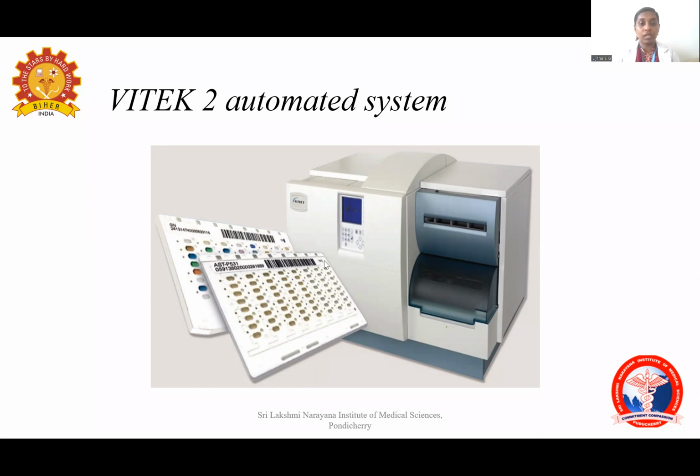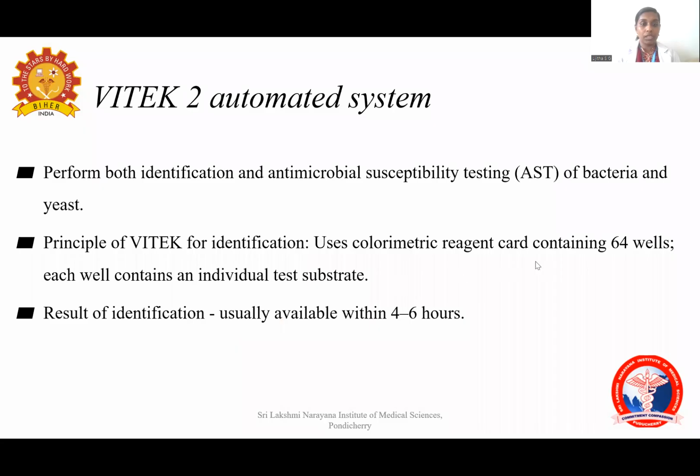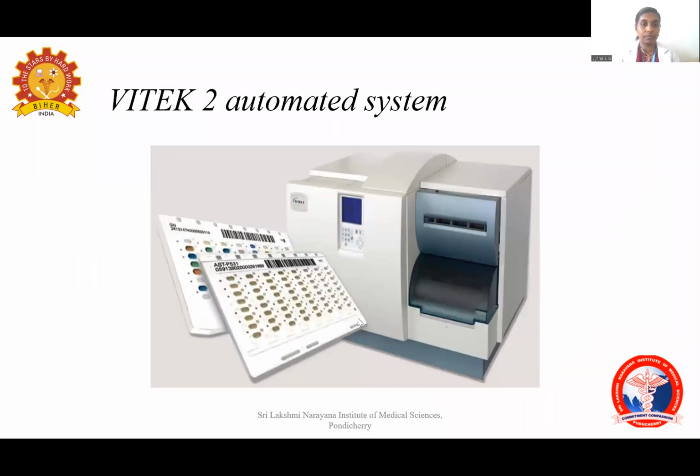So the pattern of the colors coming from the card is detected. Based on the pattern, the machine will give the identification result. The result of identification is usually available within 4 to 6 hours.